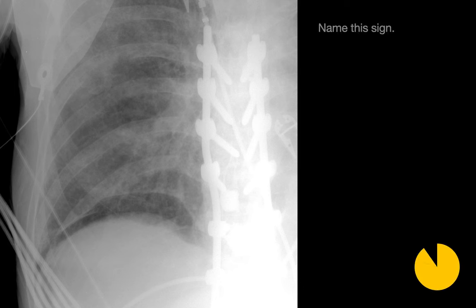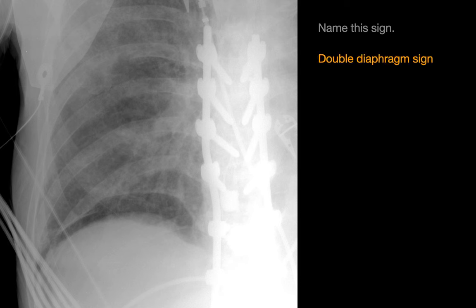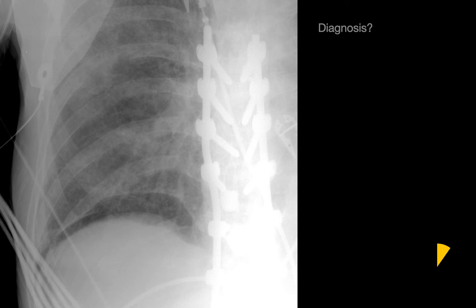Please name this sign. At the right lung base on this image we see two curvilinear interfaces. One corresponds to the diaphragm and liver, and the other corresponds to something else. We refer to this as a double diaphragm sign. When we see a double diaphragm sign, we should think about a basilar pneumothorax.